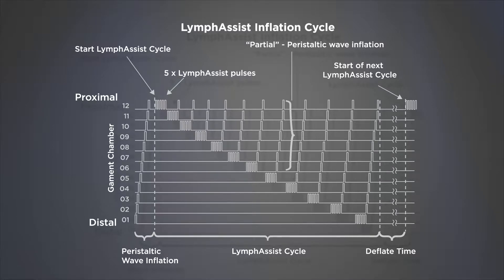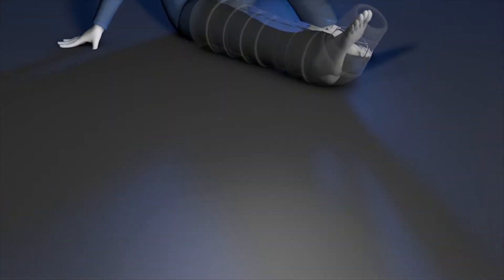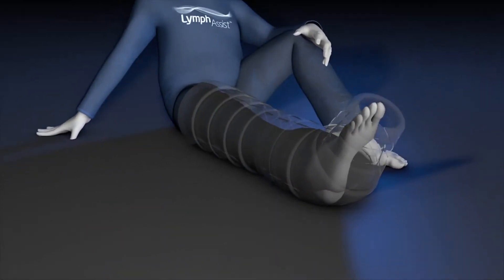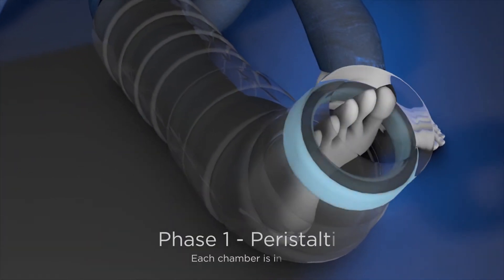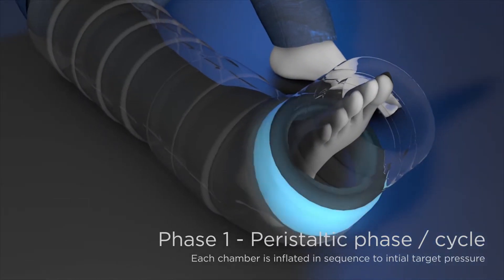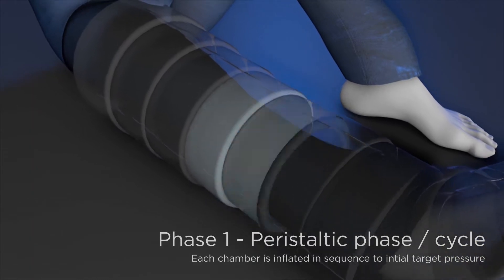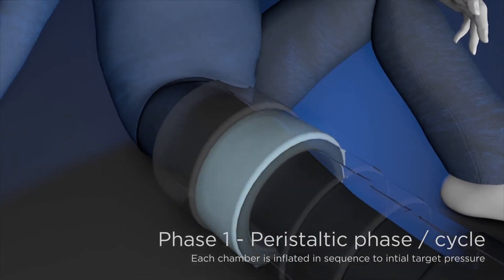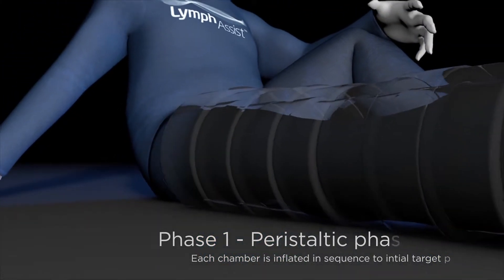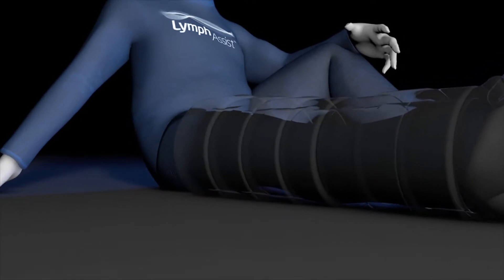The lymph assist mode is a combination of three different patterns: peristaltic waves, lymph assist pulses, and partial peristaltic waves. Having pressed the run/standby button, the system will initialize and begin the sequence. The lymph assist therapy begins by delivering a single peristaltic wave to chamber 1 through to chamber 12, and this light pressure has the effect of softening the surface tissue.